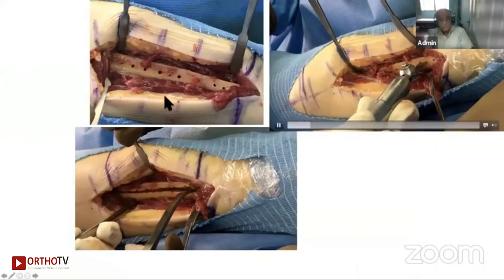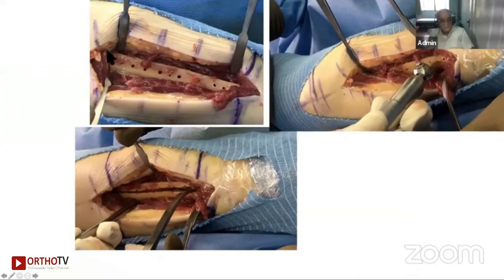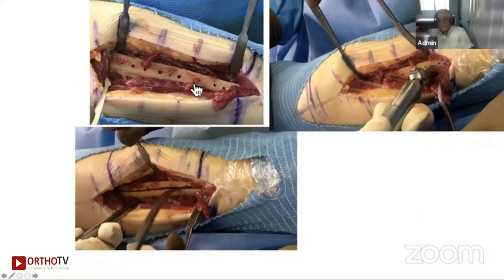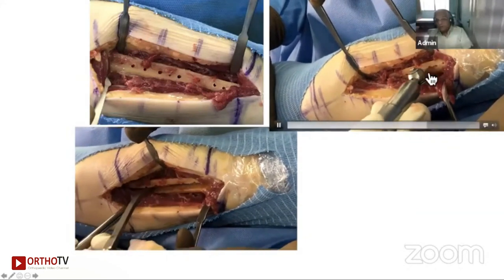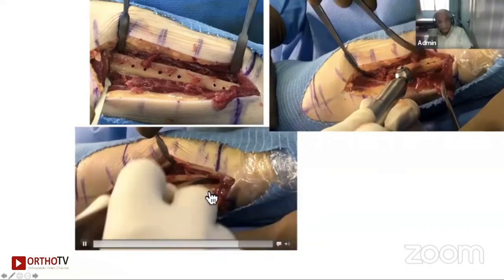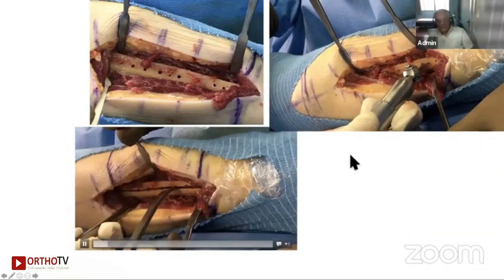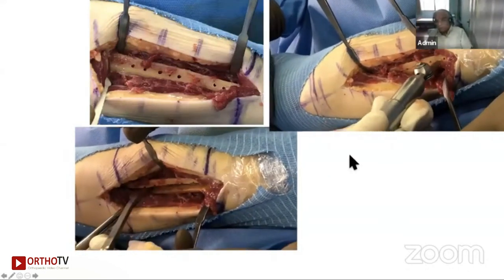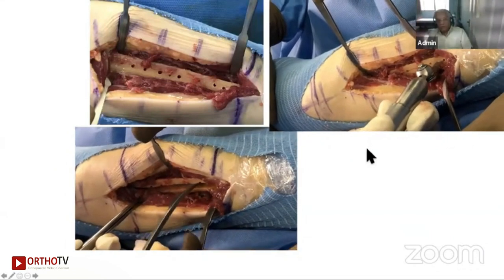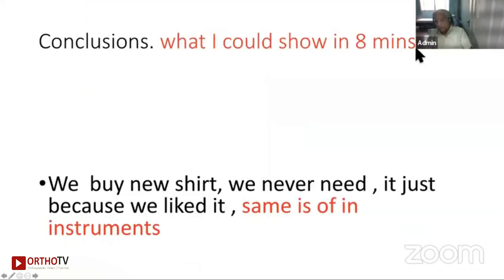And here with the same thing, I am taking half the fibula. So when you are taking half the fibula, I am making the drill holes, and with the same oscillating saw, you join them together and you can take out only half the fibula. You don't need to take out the full fibula for the humerus. And the same instrument can do it for you. So in conclusion, what I could show in 8 minutes, I've shown here. There are plenty more, but some other time.